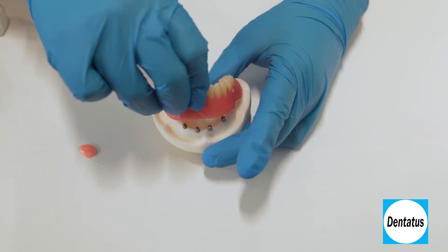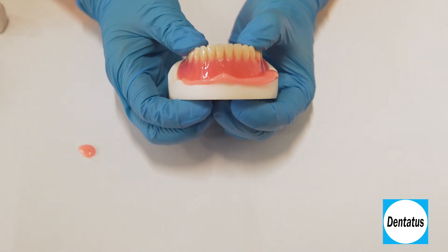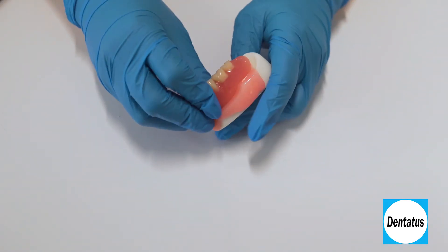Place the denture over the patient's implants from the posterior aspect. Press downward and anteriorly. Have the patient close tightly in centric position and hold for about 5 to 7 minutes. When the silicone is set, remove the denture from the mouth.